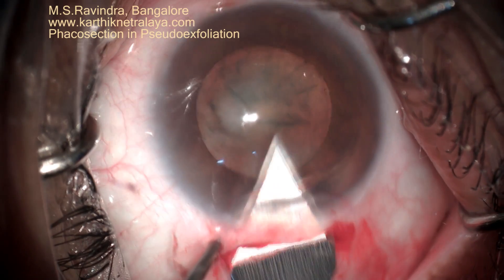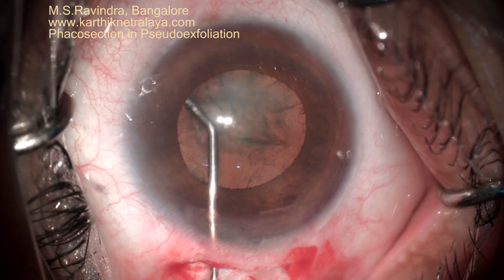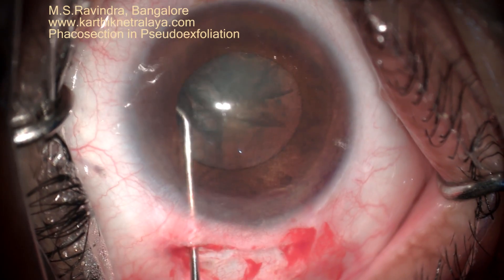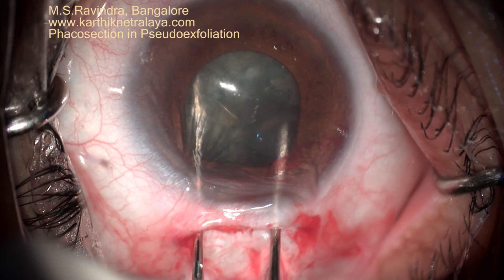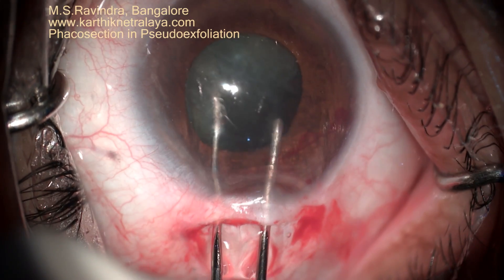Topical anesthesia plus intracameral lignocaine 1% is injected into the anterior chamber — a few drops are good enough. Good one-point hydrodissection with a special cannula. There is a floppy iris, as you can see now.